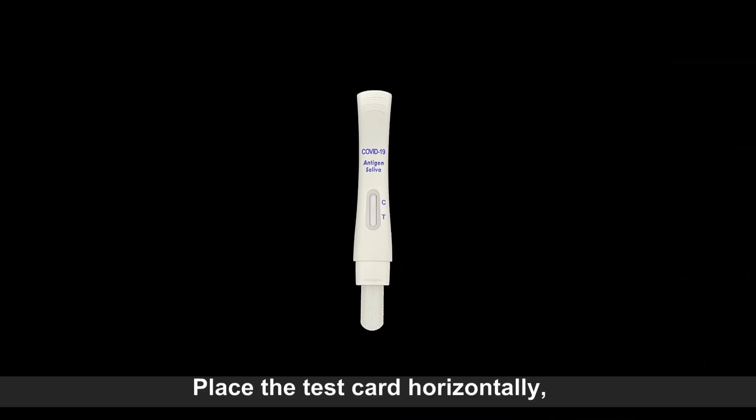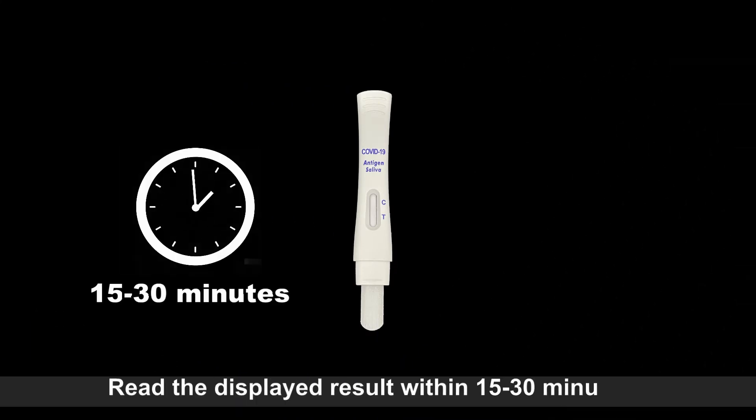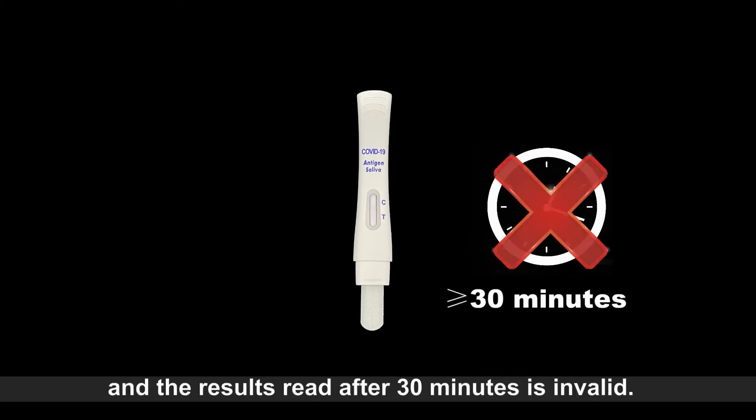Place the test card horizontally. Read the displayed result within 15 to 30 minutes, and results read after 30 minutes are invalid.